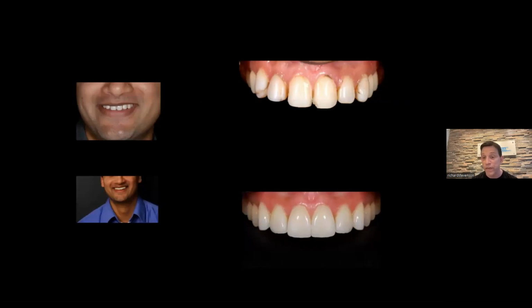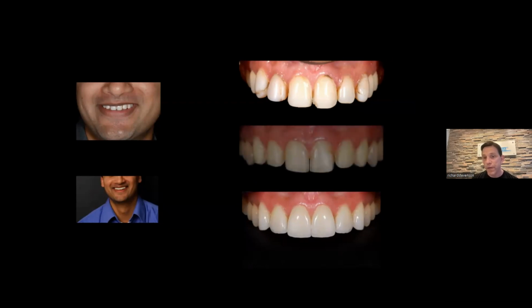These are beautiful veneers. These are the ones that did get selected. Like I said, they were not the ones I wanted. I wanted a little different look on the canines, but these were the ones that got delivered, and it was a life-changing experience for us. It was really cool. But when you looked at underneath the bonding, by the time all the bonding got removed, we had a good substrate, but sometimes you don't.